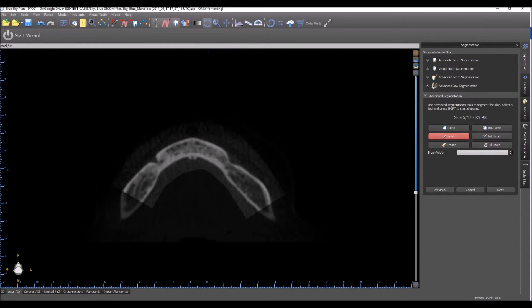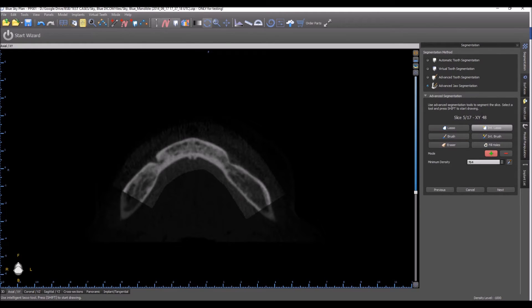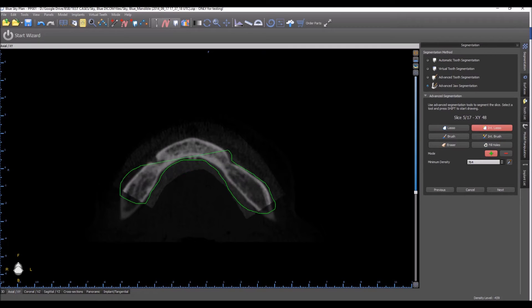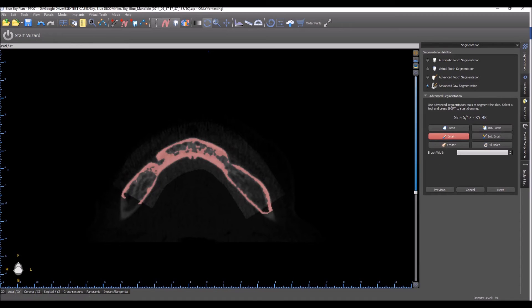Each time where I'm drawing either with the brush or the intelligent lasso, I'm holding down the shift key and using my left mouse button. Here again I'm going to use the brush to close off certain areas.